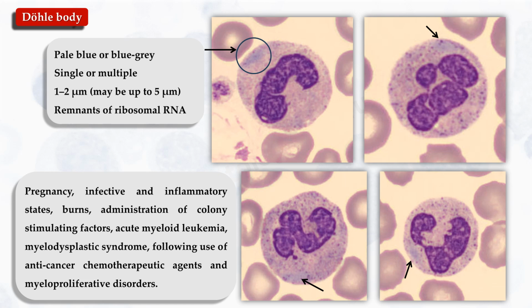They are associated with pregnancy, infective and inflammatory states, burns, administration of colony-stimulating factors, acute myeloid leukemia, myelodysplastic syndrome, following use of anti-cancer chemotherapeutic agents, and myeloproliferative disorders.